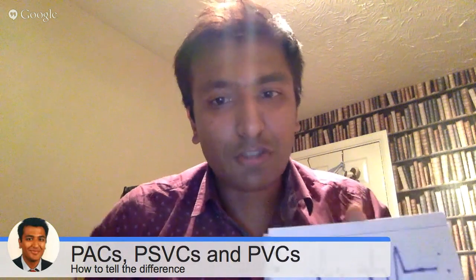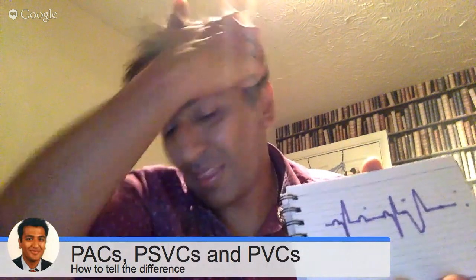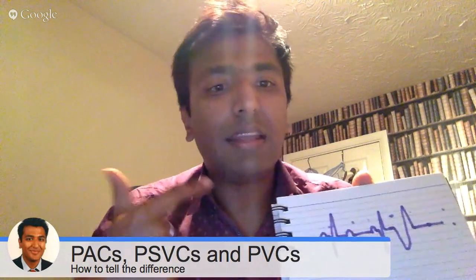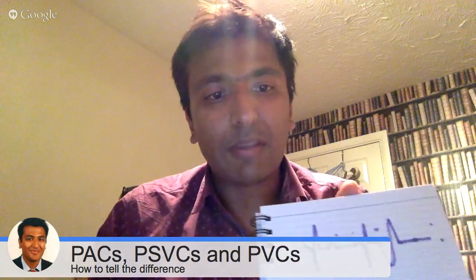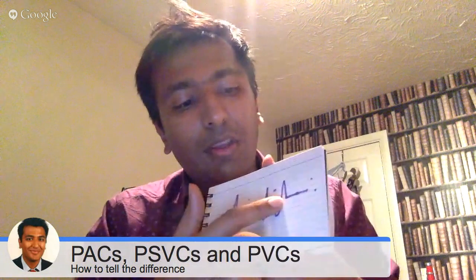So I hope this was useful. I'm sorry, it's a bit technical, but I hope it's useful. So all I think you should remember is, the first thing is that they are premature. Secondly, they all cause a reduction in the amount of blood coming out of the heart for that beat. But the lower down the impulse is, that the premature impulse comes from, the less blood will come out of it. And the lower down it is, the broader the complex on the ECG.